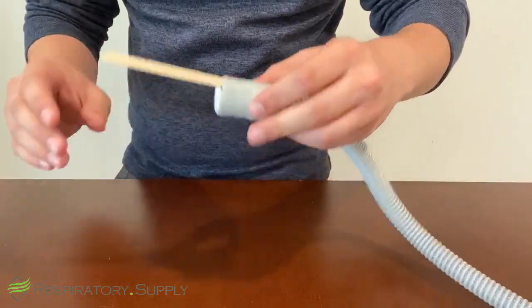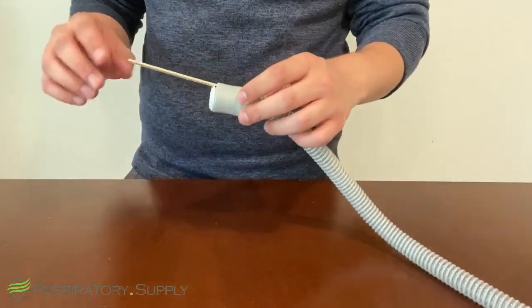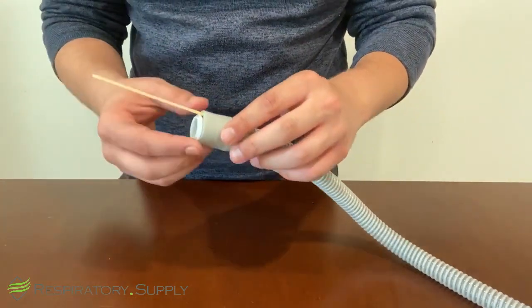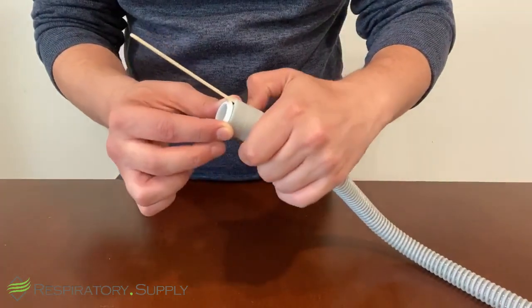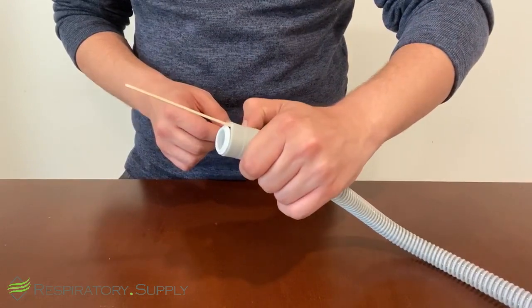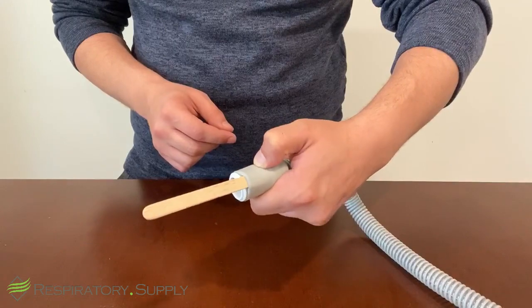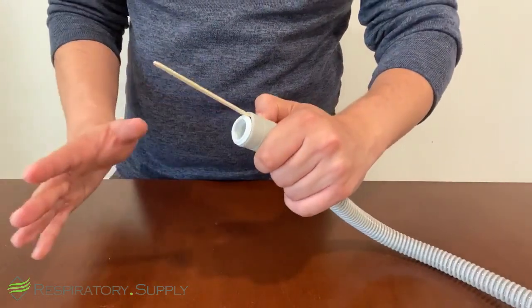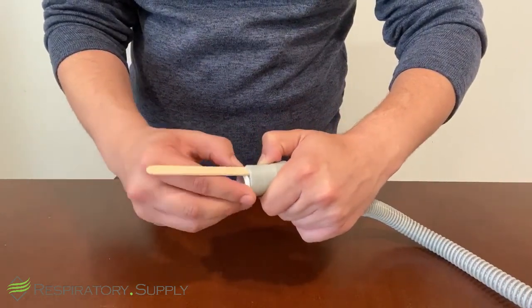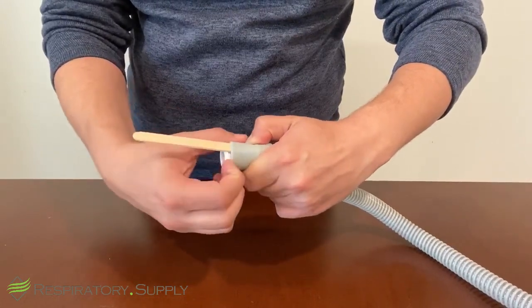Once fully inserted, go ahead and take a look. It should be about the same distance into the rubber as the connector itself. And then now we can start shimmying it out. To shimmy out the connector, what we'll want to do is once again take our non-dominant hand, but this time get a good grip with your index finger at the top, right underneath the connector and the popsicle stick, and then with your thumb, do the same thing pointed in, so we can slowly push from the bottom. And then, using our dominant hand, go ahead and grip the plastic as much as you can, and you'll want to start shimmying it out. You may need to use your nails a little bit to get the plastic.